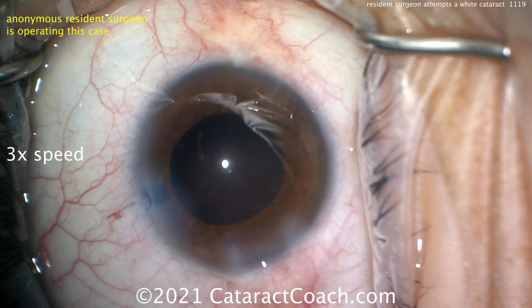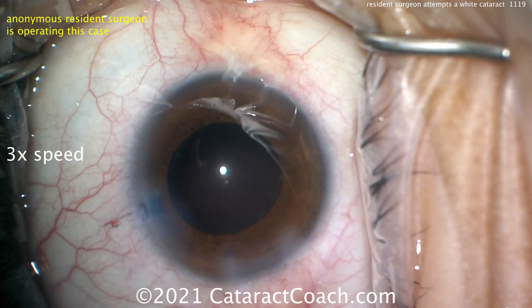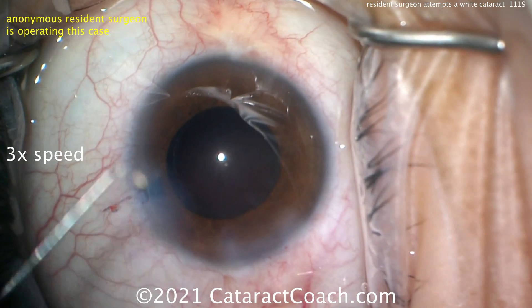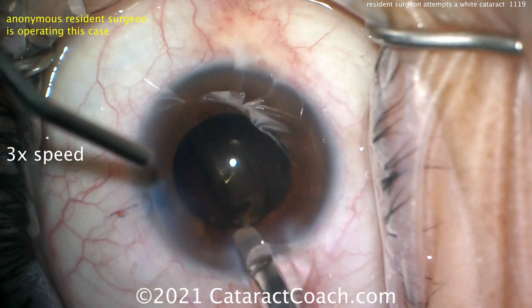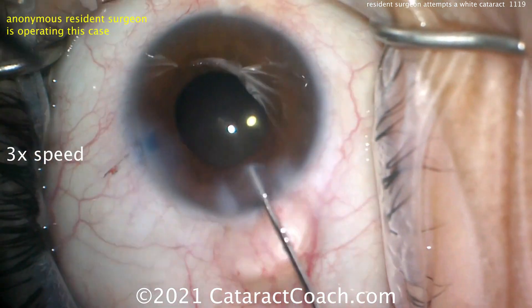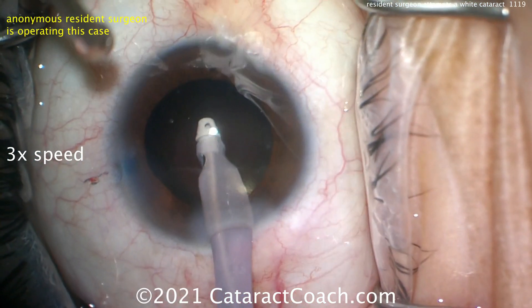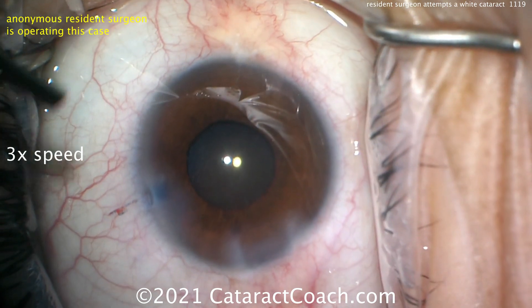Viscoelastic fill in the bag — good job. Loading up the lens. For case number 50, this looks great. I like the incisions; that main phaco incision looks like a good tunnel length. I like its positioning hitting the limbal vessels — you can see the palisades highlighted with the trypan blue dye — and the corneal stromal tunnel looks great too. The lens insertion is very efficient. This case was done by one of our residents at our sister Los Angeles County hospital. The lens goes into the bag.